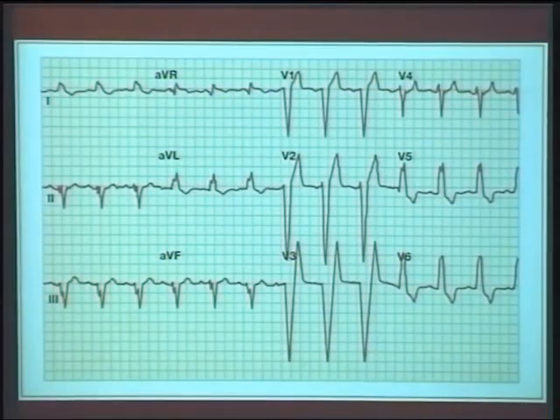So as it is being recorded, without looking at the chest leads, if you say it is a bundle branch block of right or left, people will definitely think you are an ECG pista and so on. You will have a definite approach, and whenever they see you, they see you with a lot of admiration.